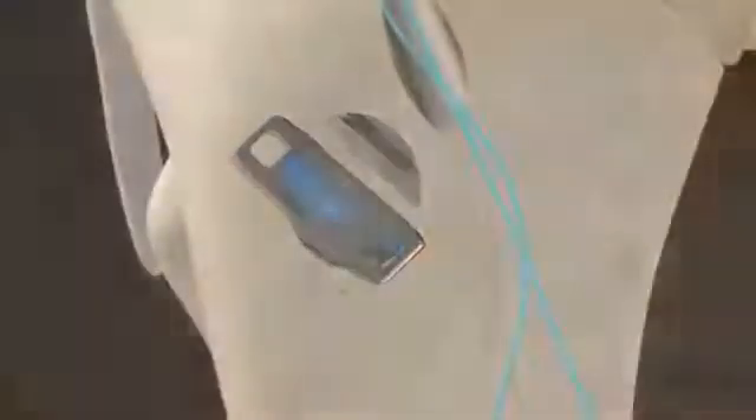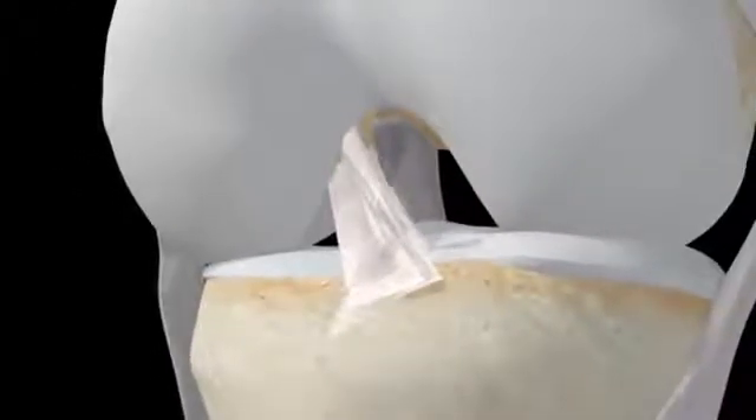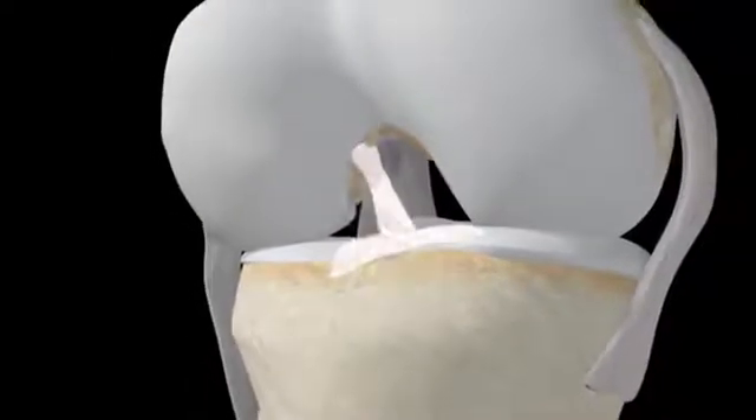A small grappling hook will anchor the upper end of the graft and a screw will stabilize the lower end. The screw is usually bioabsorbable, meaning your body will incorporate it into the bone over time. The graft from your hamstring tendon will act as a scaffold upon which a new ACL will grow. Over time, the hamstring graft undergoes changes and is strengthened, leaving a strong, viable ACL.